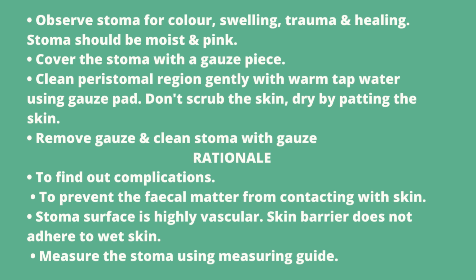Okay, remove gauze and clean stoma with the gauze pieces. Okay, for what? Stoma surface is highly vascular, right? So skin barrier does not adhere to wet skin. Okay, so measure the stoma using measuring guides like measuring tape also.